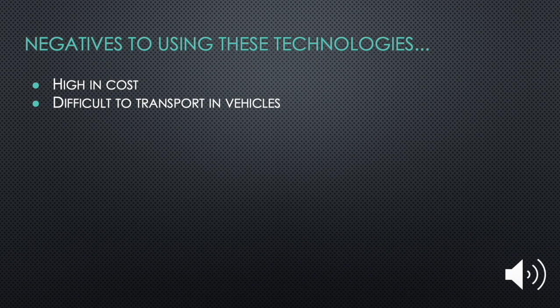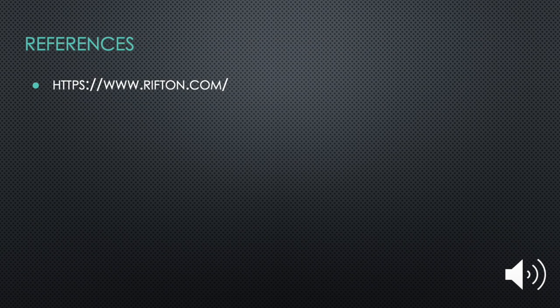The negatives to using these technologies include high cost, and they could be difficult to transport in vehicles, depending on how much you want to bring these standers to the various locations that the student goes. Sometimes students might buy a stander for home and have one in school. That way you don't have to transport. It's a high cost, but it's very beneficial for these students. So the positives outweigh the negatives.